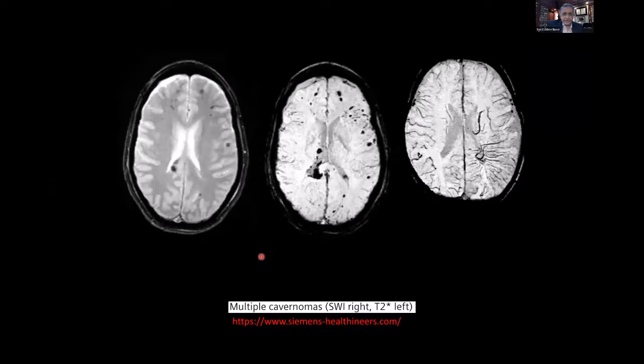Another important image is, of course, the susceptibility weighted image. There is another T2 weighted image which is called gradient echo, but that's not used so much because the susceptibility weighted image is much more sensitive. In multiple cavernomas, for example, you can see this much better in these SWI images. And if there's some kind of venous angioma, you can see that much better. So SWI is being used.